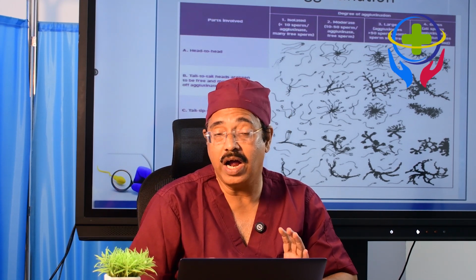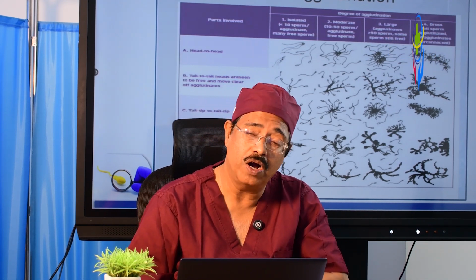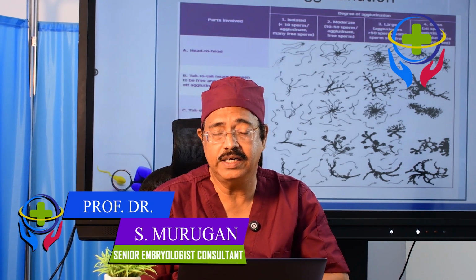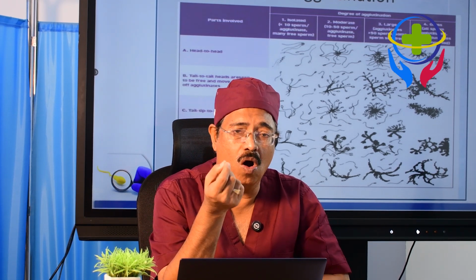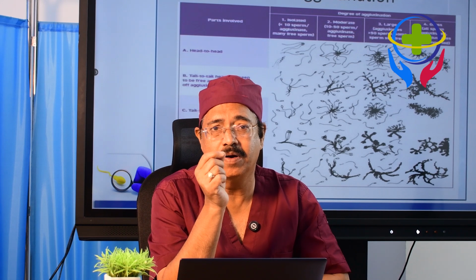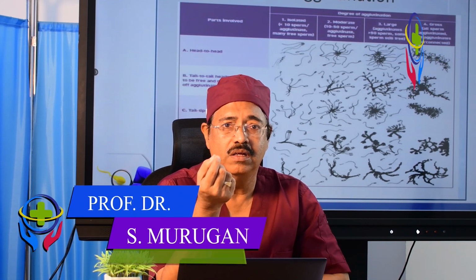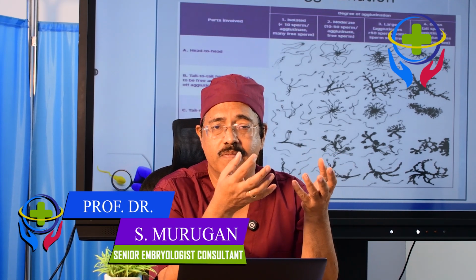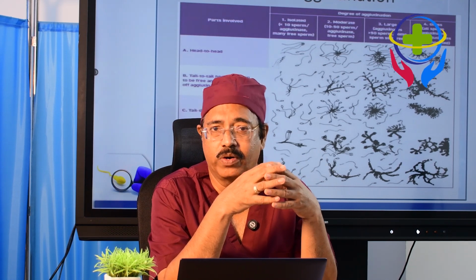The andrologist should not confuse sperm agglutination with aggregation. In sperm aggregation, the sperm are attached to debris, dead sperm or round cells, and we will not observe sperm attached to another sperm and making them immotile.